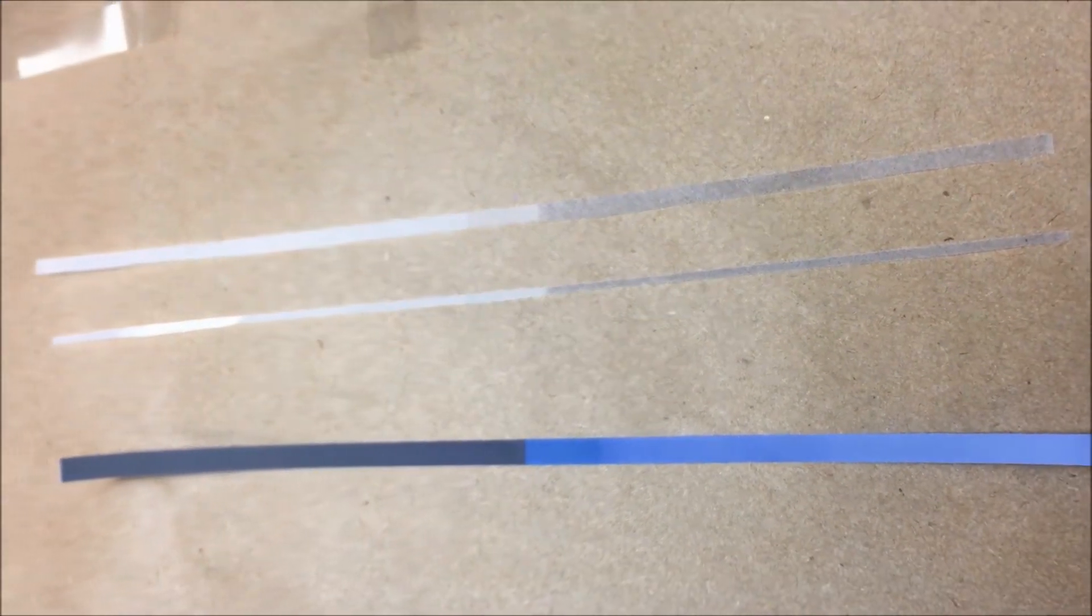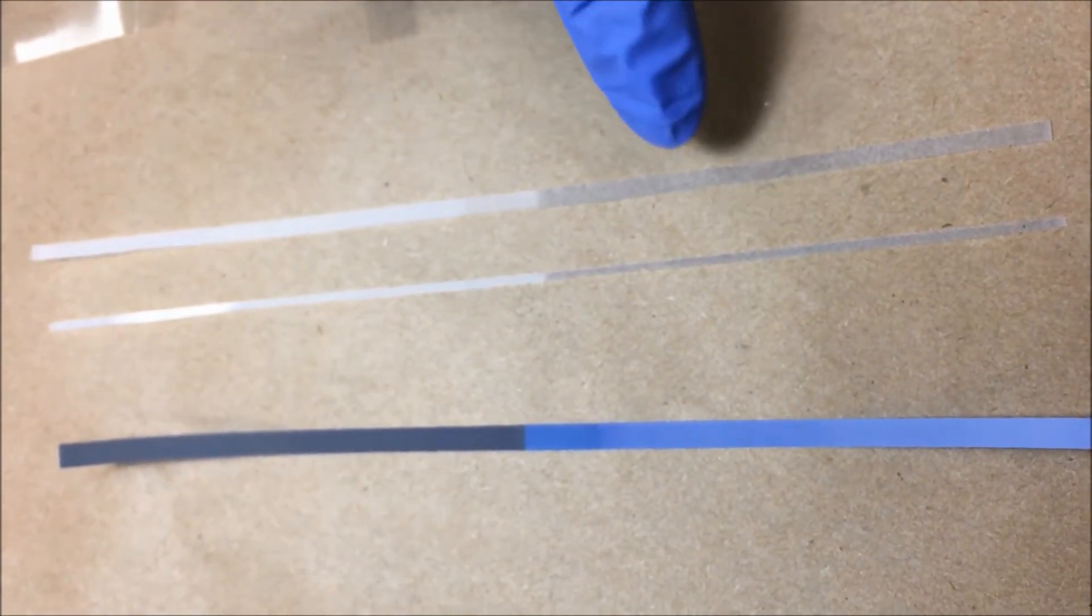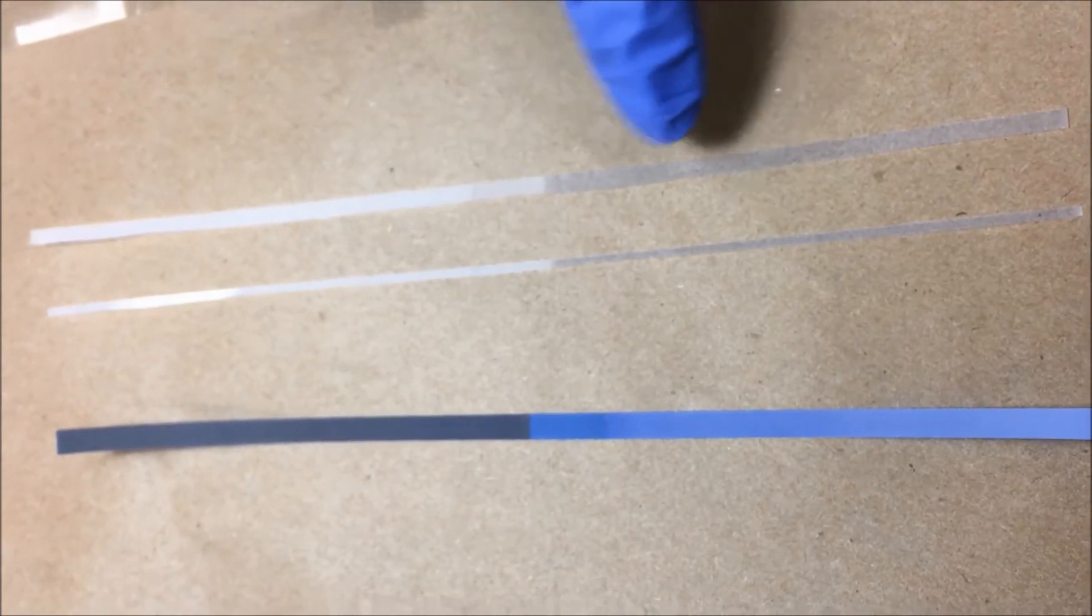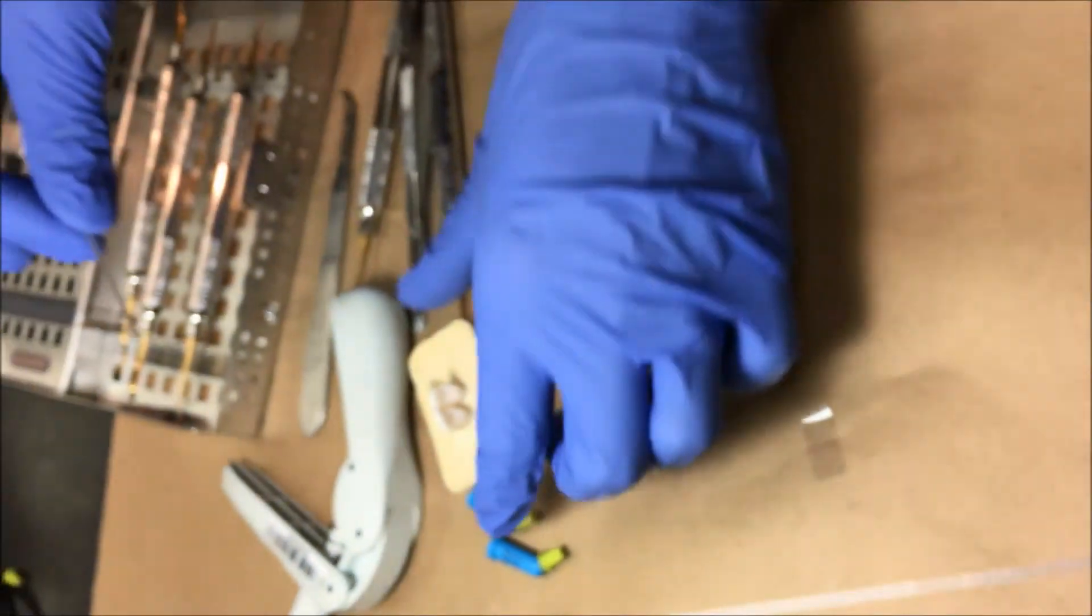Dr. Cavill actually cut these for me yesterday. They're nearly perfect of course. But see what he's done. He's cut one real thin and one a little thicker. Or you can cut straight down the middle. What's the advantage of this?